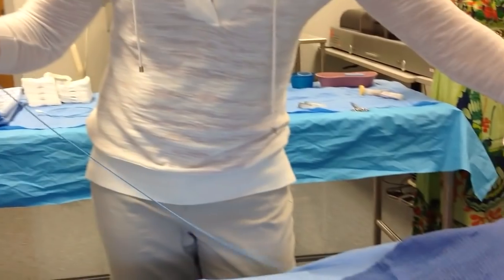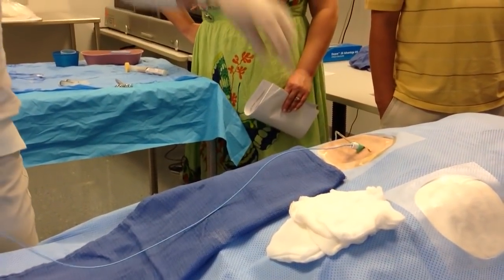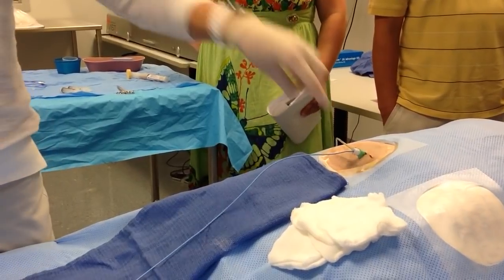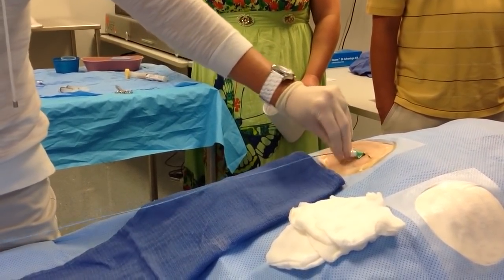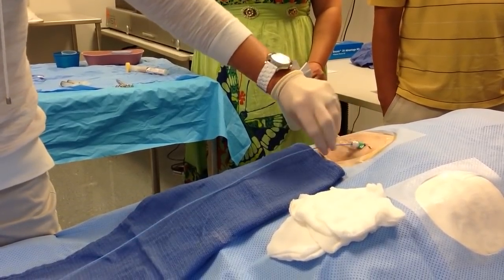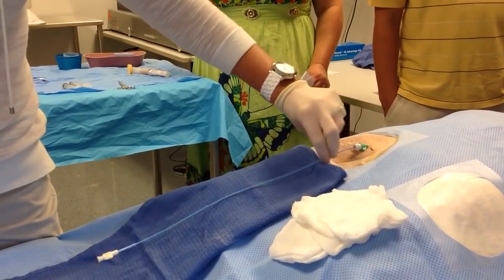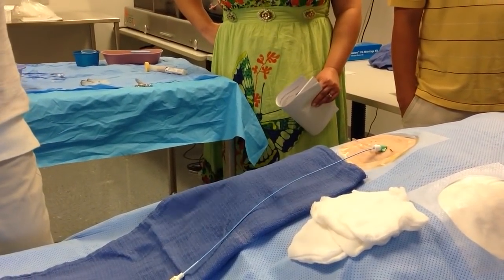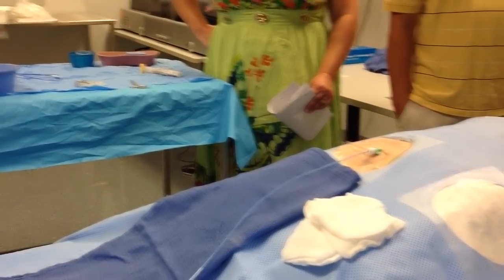So we would be watching the guide wire go up the aorta over the arch. And once we see it over the arch here, then they're going to advance the catheter. And this is what they would do if they were by themselves. So you pin the wire, and they're advancing the catheter. Once the catheter meets the guide wire over the arch, we're going to pull this out here.